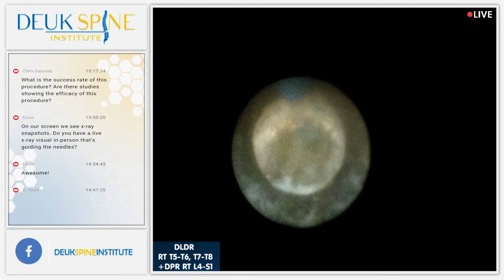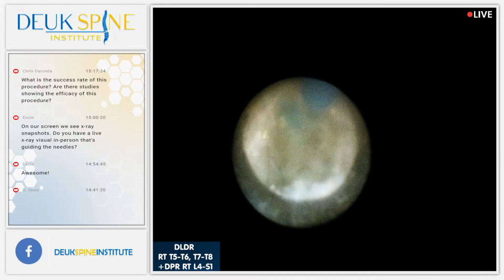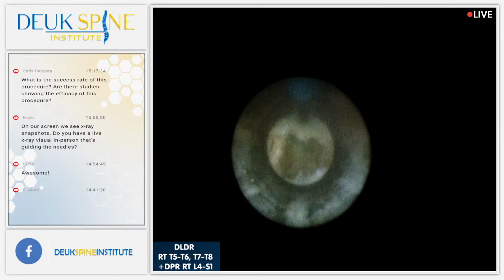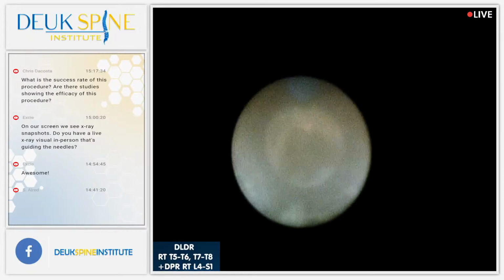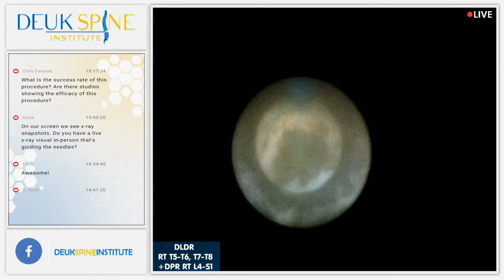At that point I realized the risk of pursuing 5-6 aggressively could result in a complication, because of that bone blocking it. So I said, no, this is not worth it for my patient to have a complication.